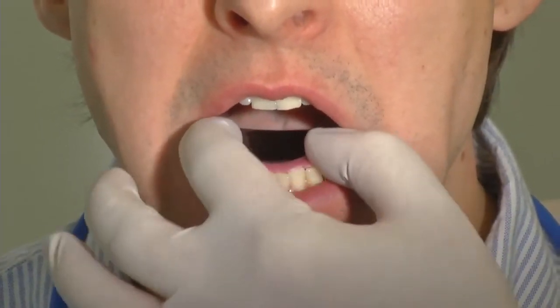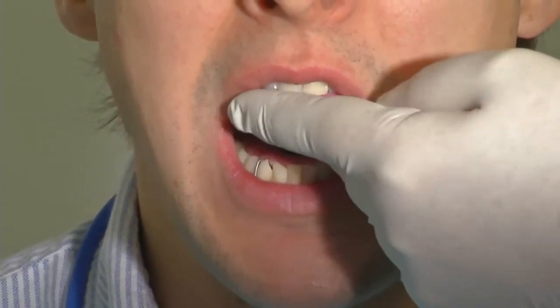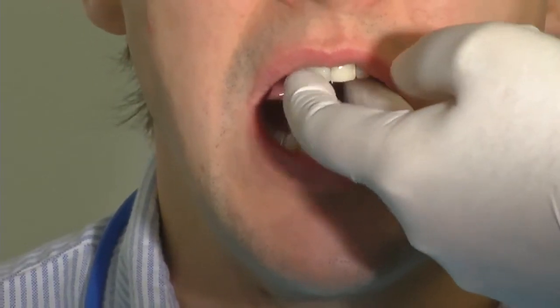The mandibular registration plate is generously blacked with the marker provided. After putting the templates in the patient's mouth and following the dentist's instructions, the patient traces the angle by laterally moving the anterior and posterior mandible.